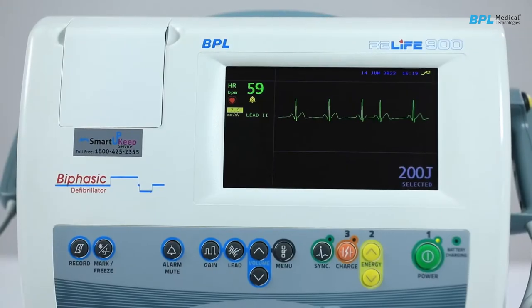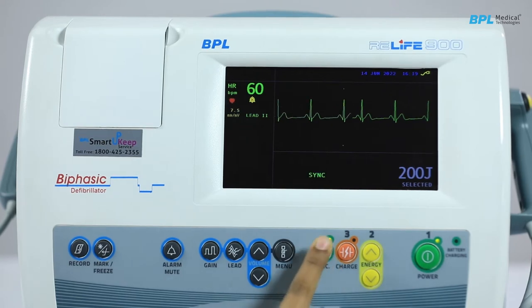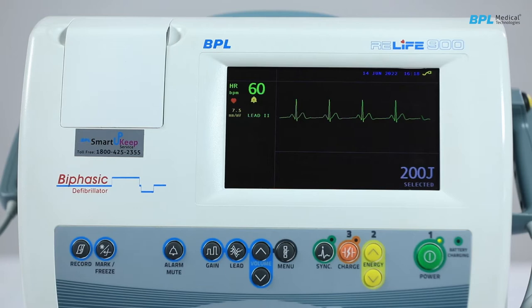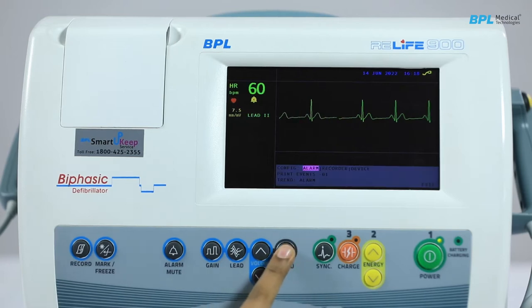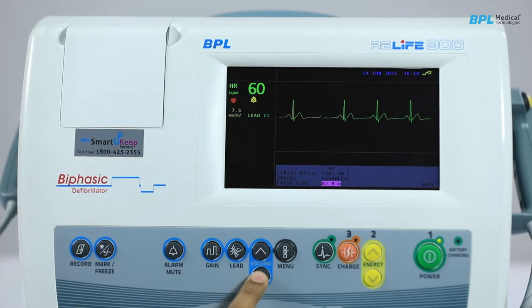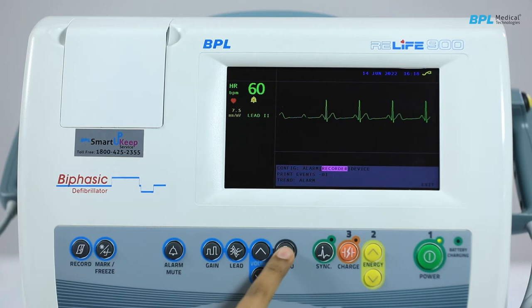Sync button. The LED located in this key is illuminated in the synchronized mode and a sync message is displayed on the screen. The LED blinks during every QRS detection. Menu button. Displays a menu on the main screen. Volume up or down keys are used for navigation, and the menu key is used for selecting any of the parameters displayed on the menu.